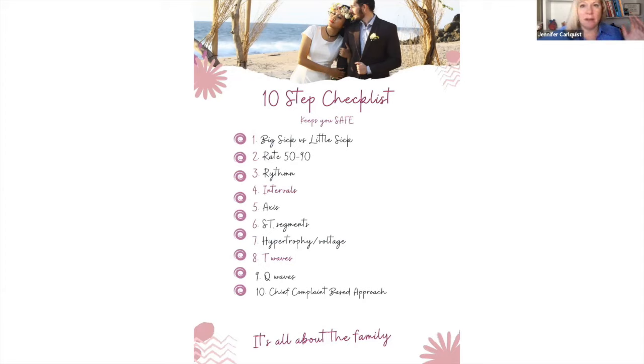And so it's all at the end of the day about the family, right? Because the mom, the dad, and the baby, are they all together? Are they all holding hands? And that's part of how we solve the mystery of what's going on.